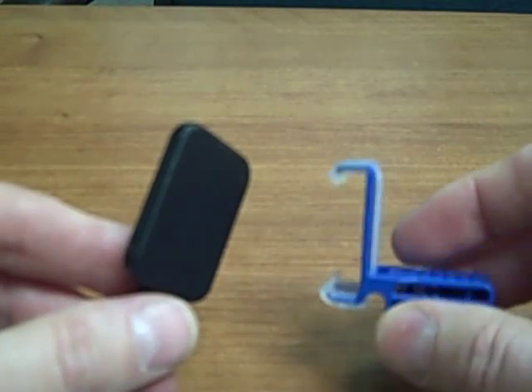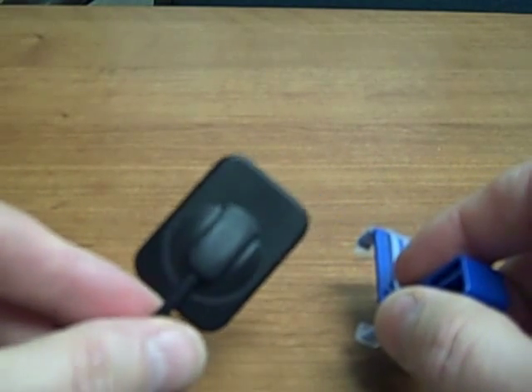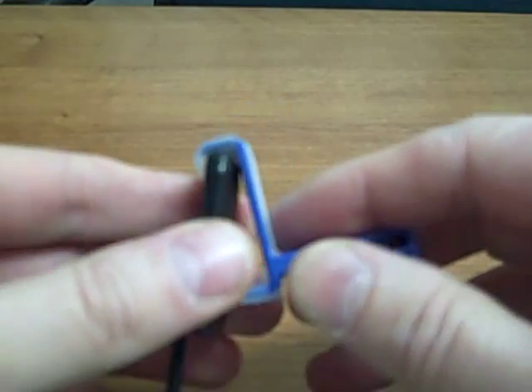This is a demonstration of the RIN XCPD-SFIT Universal Bite Block System, and here we're going to show it with an XDR sensor. This is the brand new CMOS sensor.